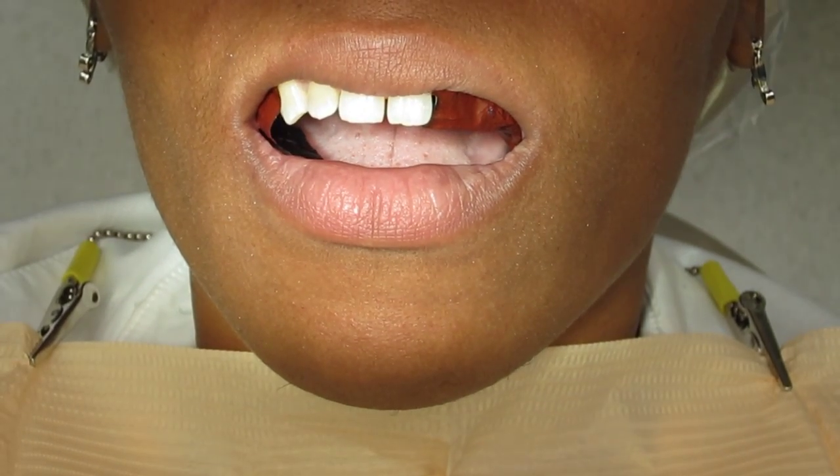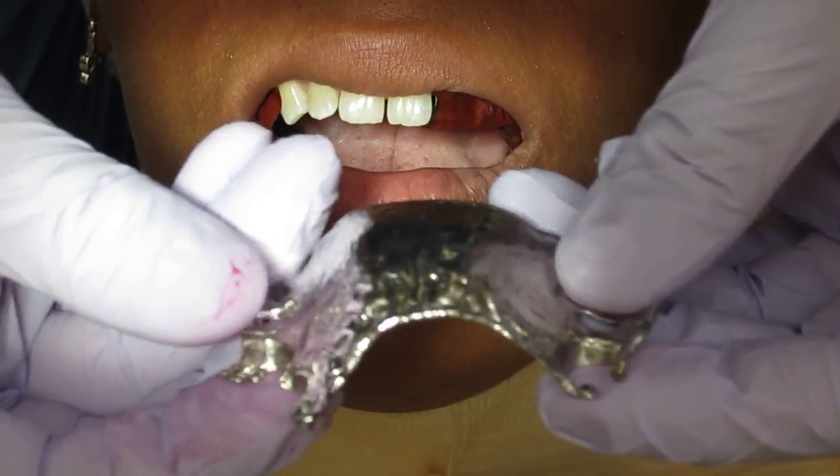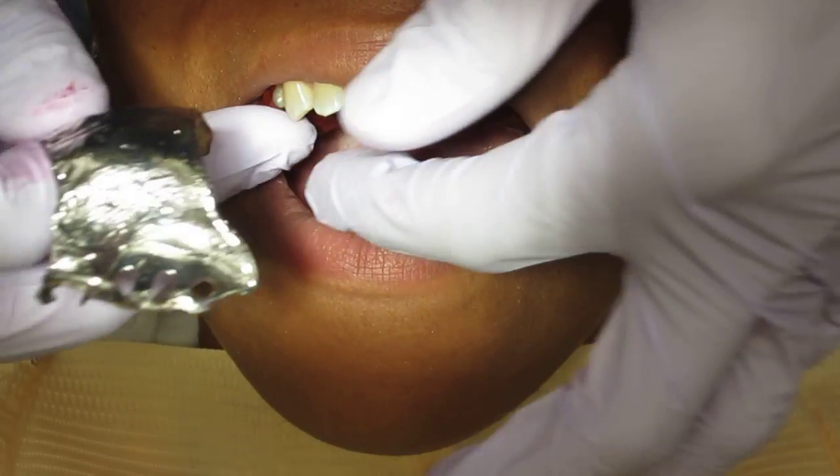Hi folks, Ashley here from AllThingsDentistry.com, and today we're just trying this Maxi RDP. You can see my fingers are all red. We're using articulating papers. This is something different than I was taught.